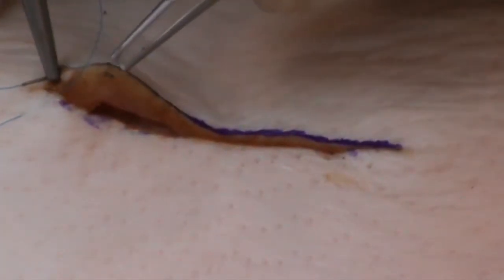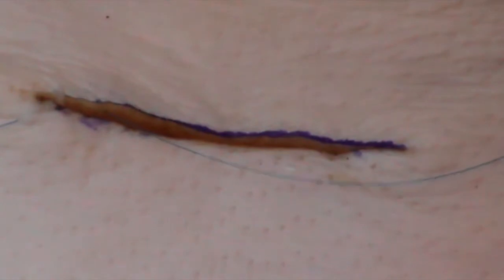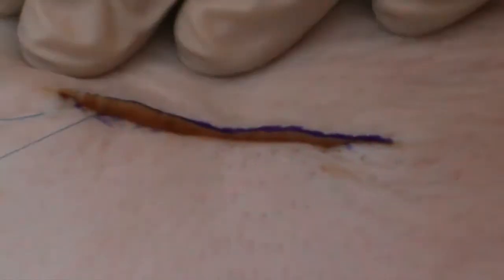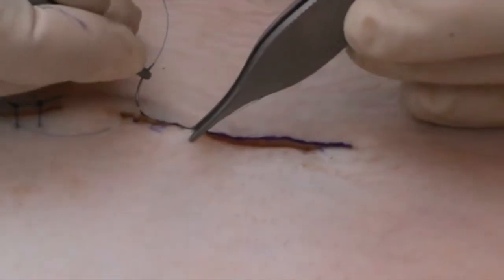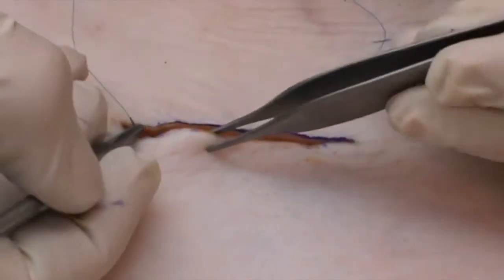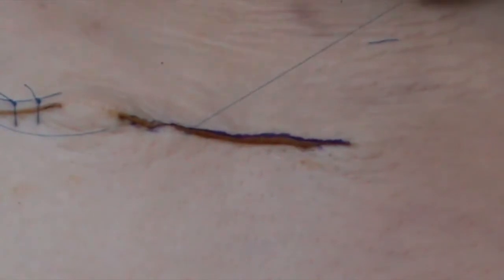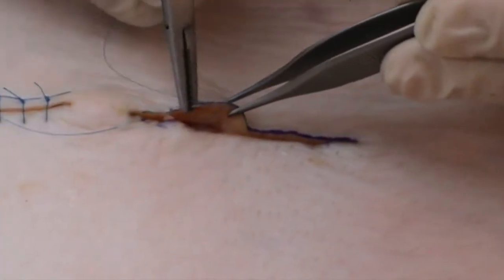So here we go — out, just below the epidermis. And then when it comes to the next step, inserting the suture on the other side, you'll see that where this comes out, I want to insert just behind there. So in fact I would be inserting at this level, coming out here, and then reinserting just behind, at that area. What you want to avoid is putting your suture inserting it ahead, because then you will tend to gather the wound together and get a poor cosmetic result.